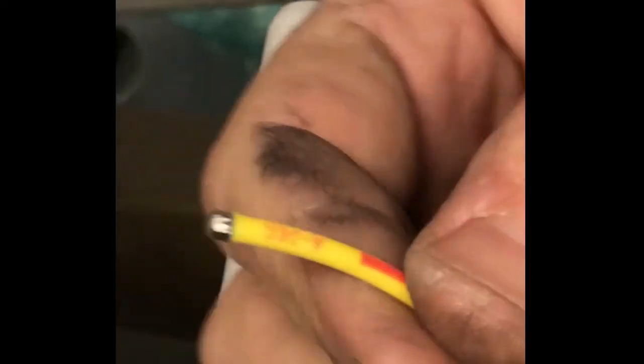I'm going to take it and insert it in there. I'm going to have a nice straight insertion. Then I'm just going to spin it in circles until I feel that it's engaged. And then I'm just going to shove it, and then I'm just going to pull back. I'm just going to pull out. And dude, freaking A, check that out. This is amazing. This is amazing.